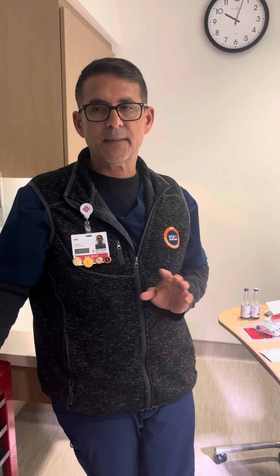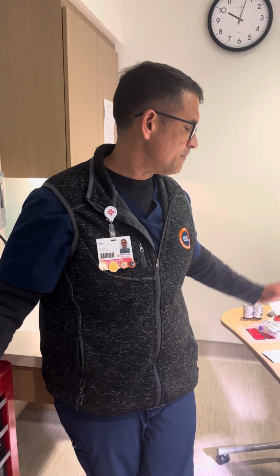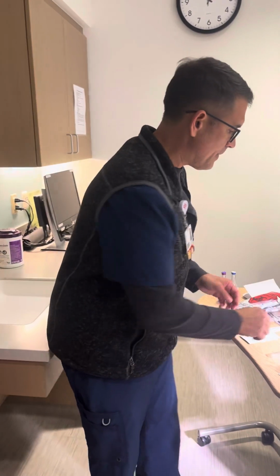There are tips and tricks on how to identify your vein before you go to poke it, and I think I might have shown that on the last video, but it's definitely on the adult blood culture video, so I'm not going to go over that right now because you guys are going to watch that one too. So you're going to put your tourniquet on, you're going to identify your vein, you're going to scrub vigorously for 25 seconds, and then you're going to pick your needle.